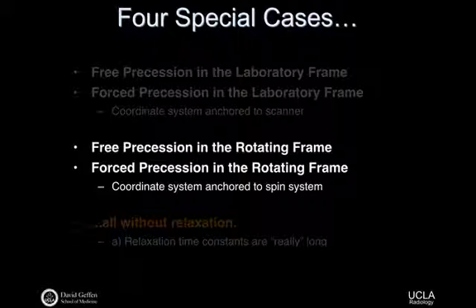Okay, so why is that such a good thing? Well, when we're done, the idea is that in the rotating frame, our RF pulse has gotten to have a slightly simpler description, and it just looks like B1e of t, same envelope function, but simply oscillating or doing whatever that function is doing along a single direction, the i hat prime direction. So all of these terms sort of collapse to a 1, and some drop out as a 0. Okay? So this is actually really nice, right? Because this just says, if we're talking about what the B1 field does in the rotating frame, it really just depends on that envelope function.